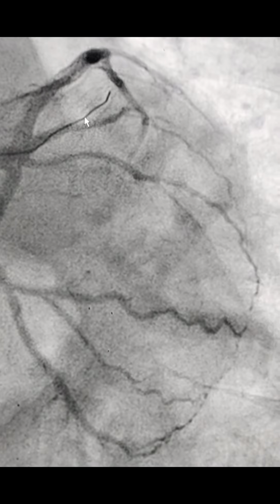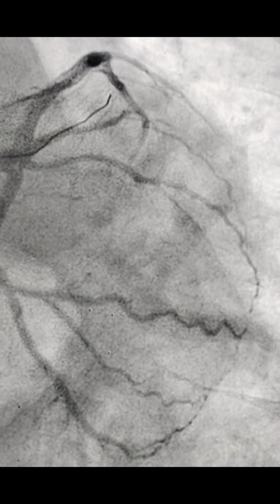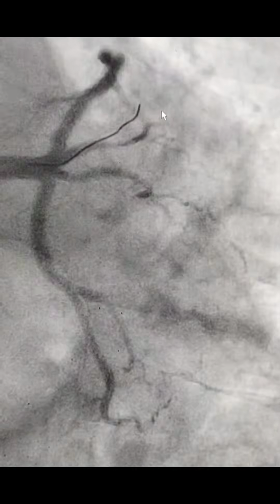Now what we could see is we wanted to stent the second LAD, but after putting the wire in this second LAD, there was a thrombus and it got closed. This LAD has to go like this, but everything has got closed. This LAD has got closed because of the thrombus migration. So you could see the wire is in this second LAD, but there was no flow in the LAD because of the migration of thrombus.